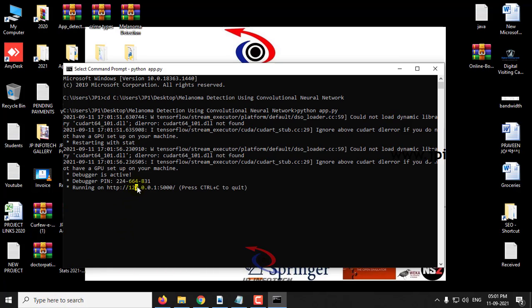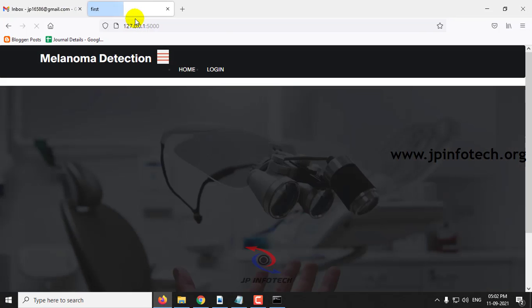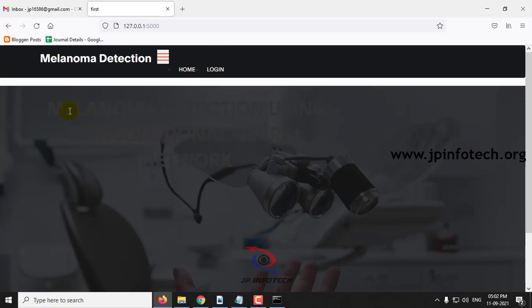Now you can copy this URL, go to your browser, paste it, and now you can see the home screen or welcome screen of the project with the project title.